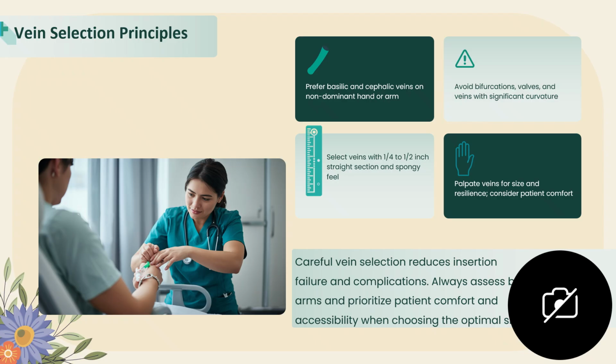I add here also some principles for vein selection. Careful vein selection reduces insertion failure and complications. Always assess both arms and prioritize patient comfort and accessibility when choosing the optimal site.